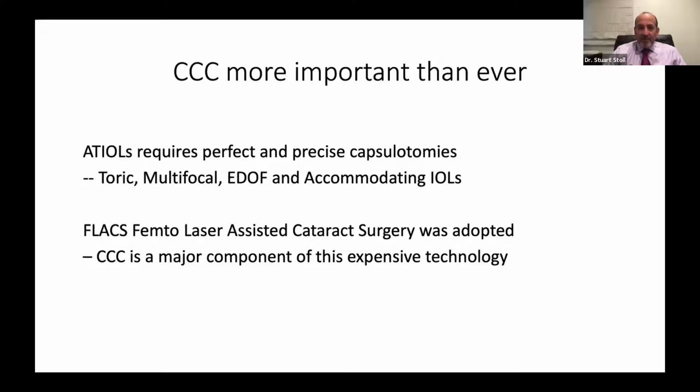But you have to have your skills down. Even if you have access to a femto laser for cataract, you have to have your skills down. There are going to be times when you can't use those lasers, pupils too small, or many of us are just not going to ever have access to those. Or in the beginning, I was a very early adopter of FLACS, and it was actually more challenging doing surgery with the laser because we'd have tags, and if you pull on the capsule wrong you'd have a weak spot and it would run out. That's largely been resolved, but as an early adopter, we had to know how to manage those issues.